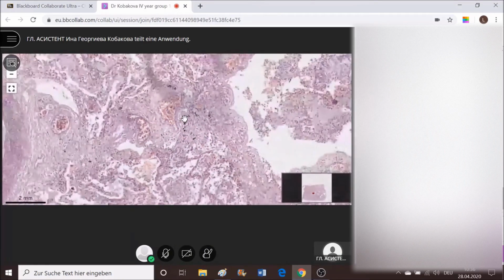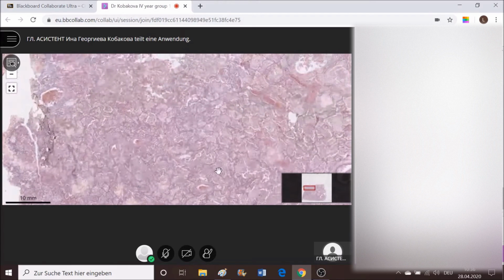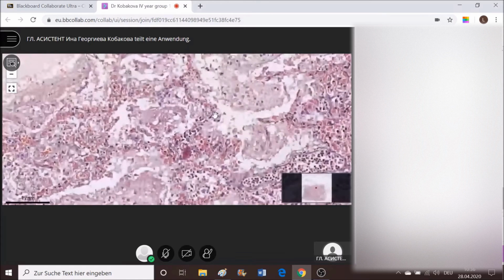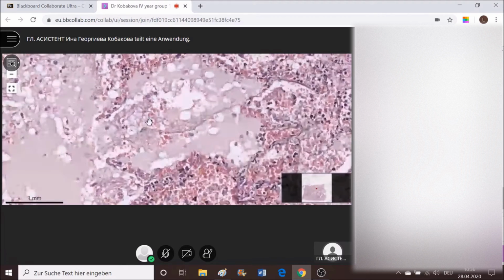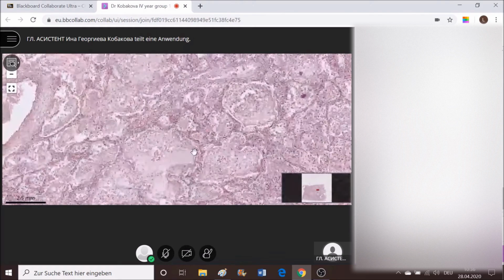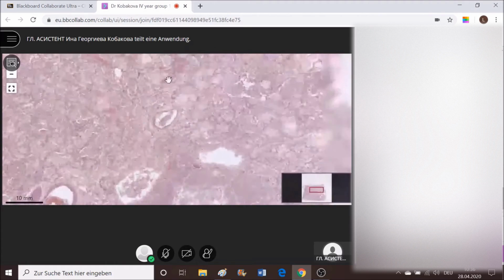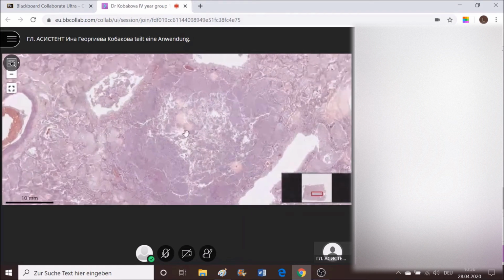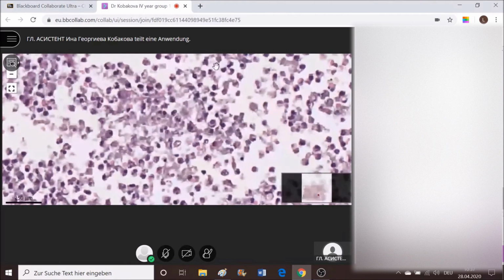When you describe that it's a lung, that it's suffering severe hyperemia, pulmonary edema, all of the alveoli are filled with inflammatory fluid, which is majorly made of erythrocytes. And take a look at these cells. I'm going to ask you, what are these? Let's just find a larger field with inflammatory cells. Well, this is exactly the field that I'm going to ask you about, but let's check out what are these cells. What are these inflammatory cells here?